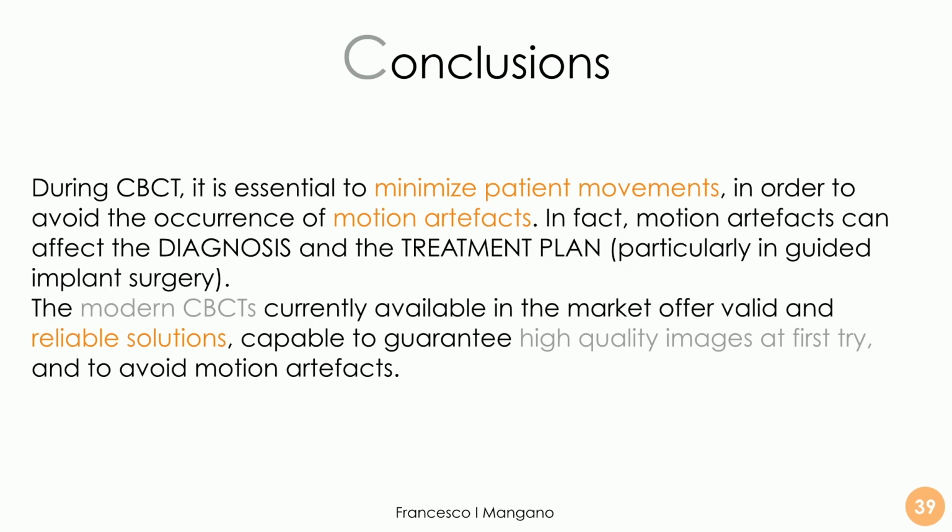So the conclusions. During the cone beam computed tomography, regarding the position of the patient, we have different articles talking about the supine position, the patient sitting, the patient standing. But the point is that we absolutely need to minimize patient movements in order to avoid the occurrence of motion artifacts. Motion artifacts, in fact, can deeply affect and jeopardize our capability to make the proper diagnosis and then to plan our treatment well. For example, in guided implant surgery it is very delicate. We need to avoid motion artifacts absolutely.